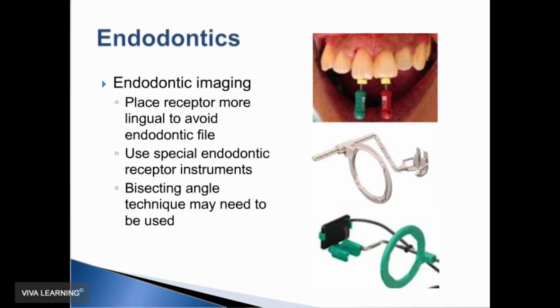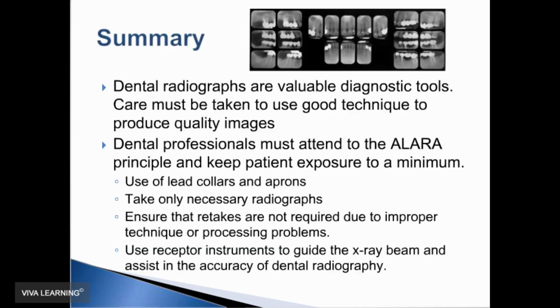Typically, these are the tip of the nose for the maxilla, the incisor area, the ala or corner of the nose for the canine area, down from the pupil of the eye to mid-cheek for the premolar area, and down from the outer corner of the eye to mid-cheek for the molar area. And you can drop those same lines or points down to the mid-mandible for the beam to enter on that arch.